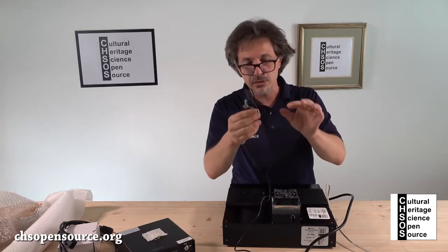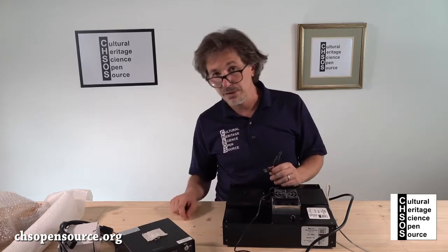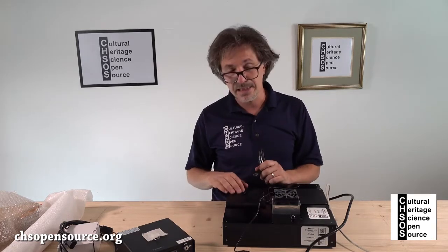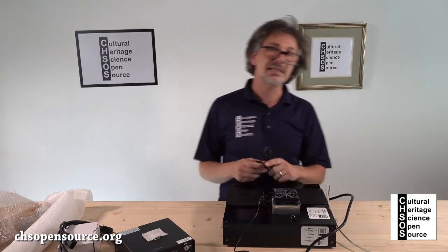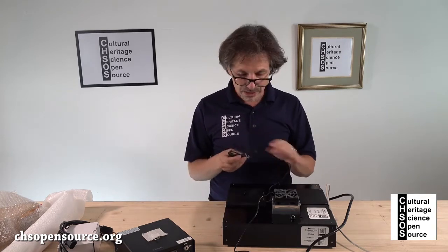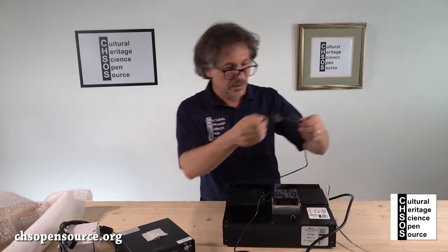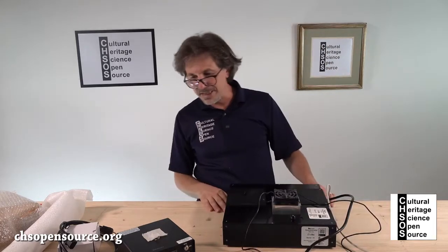Then we have another cable — a black USB cable without any switch. This one is the cable for the camera inside the spectrometer, so you can take pictures of the areas you are actually analyzing. This one will go into the computer.